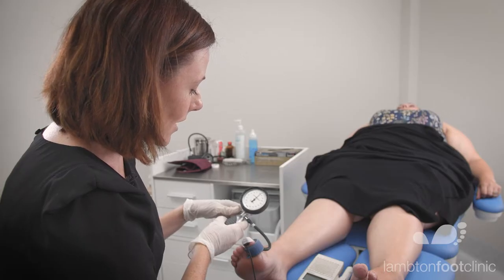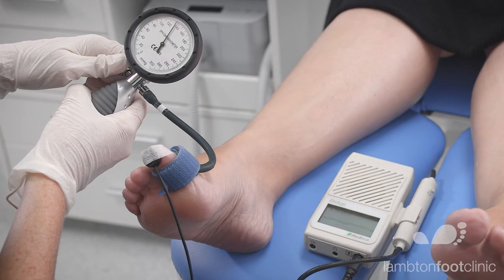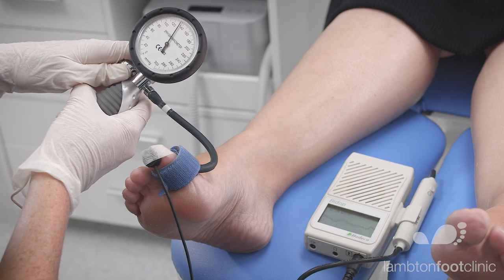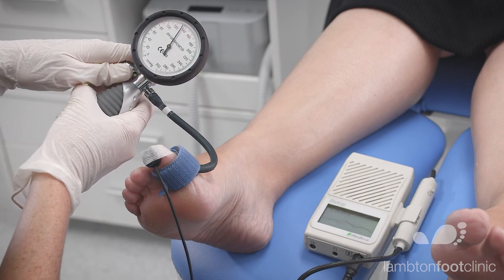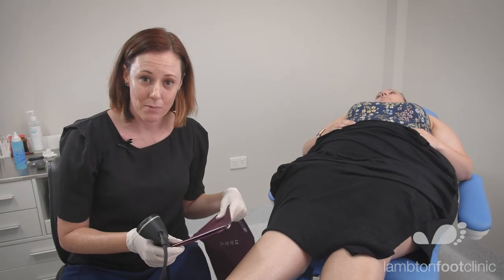And we're just watching for that first initial upstroke. There it is. So it's 132. So now we need to take our brachial pressure.